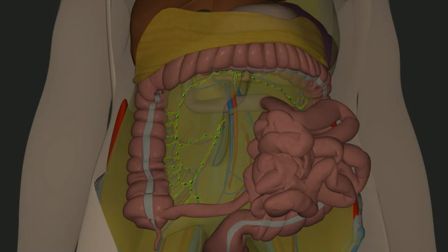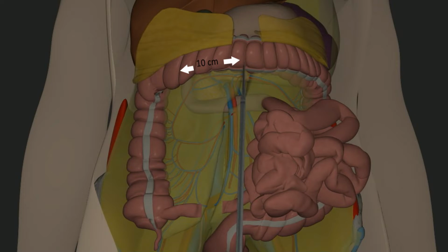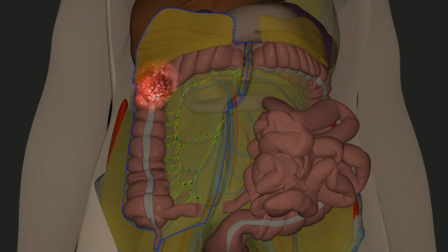As mentioned before, lymphatic spread to the pericolic lymph nodes can be found within 8 to 10 cm from the primary tumor, but no more than that. Therefore, the transverse colon is transected at least 10 to 15 cm distal to the edge of the hepatic flexural carcinoma.